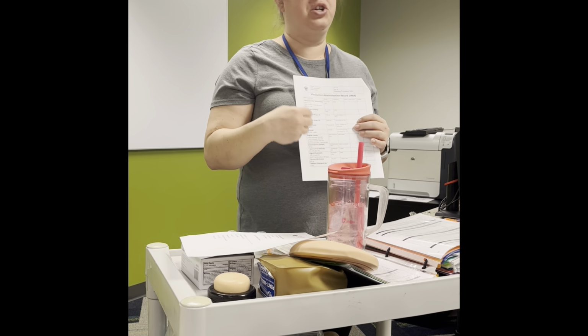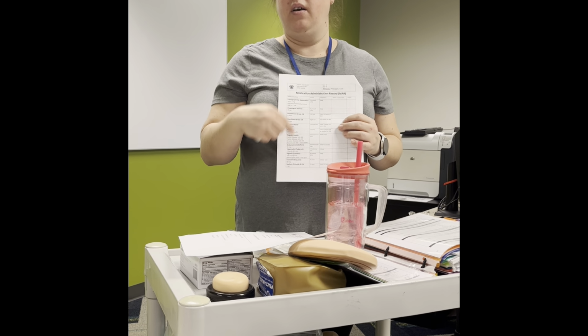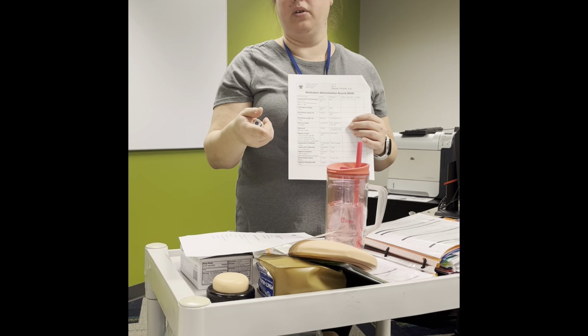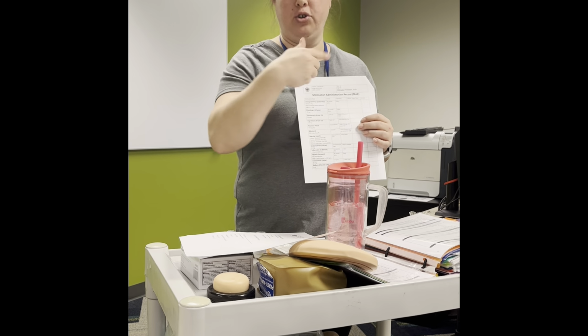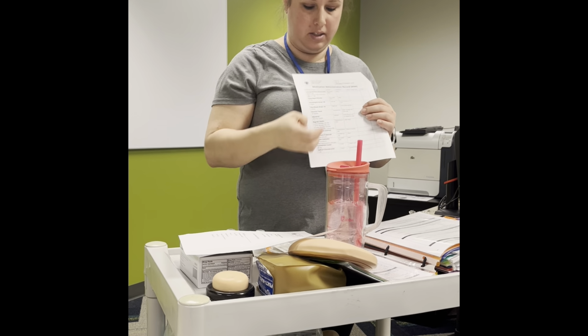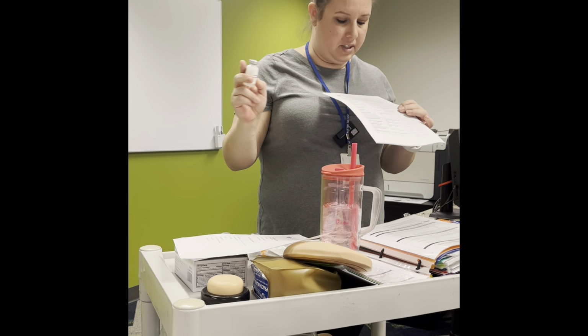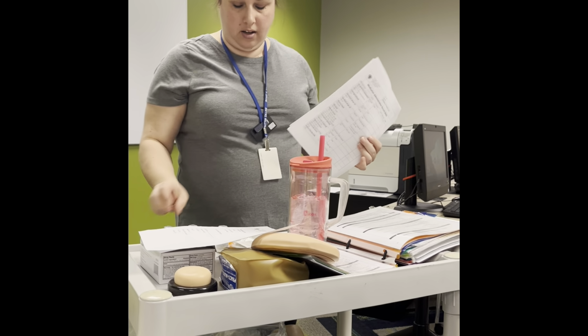If you have one on your sheet, let's say it's 425, it will say consult doctor. I will tell you how much you will give. So I just want to make sure that you're looking, to put the pieces together. So you have a regular insulin, expires 12 of 2026. I have liquid, it's subcutaneous, and I'm going to give it.